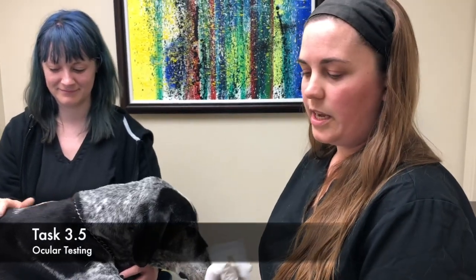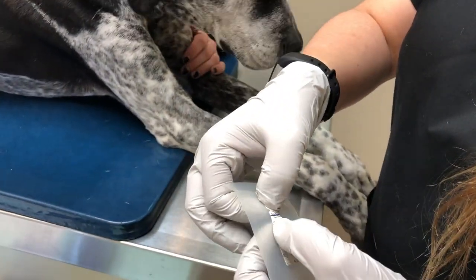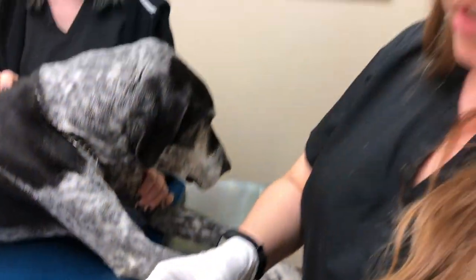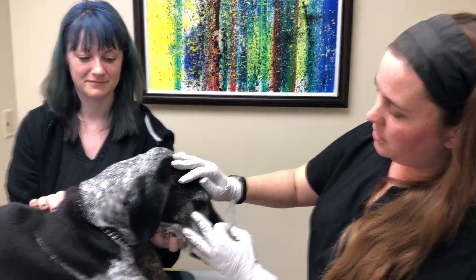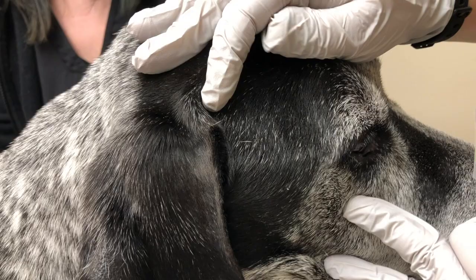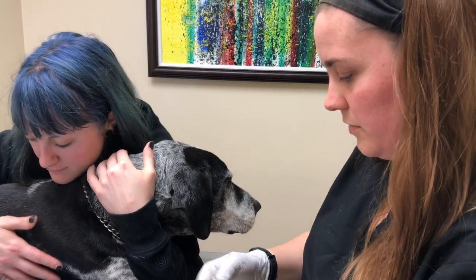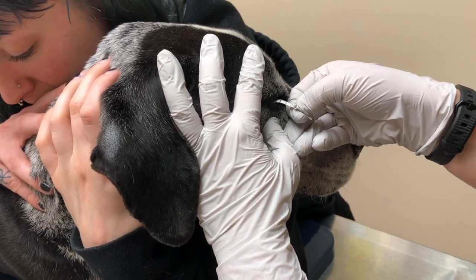So to begin the test, I have our strips here that are sterile, and what I want to do first is bend at a 90-degree angle right at that blue mark, or 5 millimeter wetting per minute mark. That way it's still sterile, and that part is going to sit just under the lower eyelid, between the lower eyelid and the cornea. I don't want it to be between the lower eyelid and the third eyelid. And what this is testing for is that we have an appropriate amount of tear production.